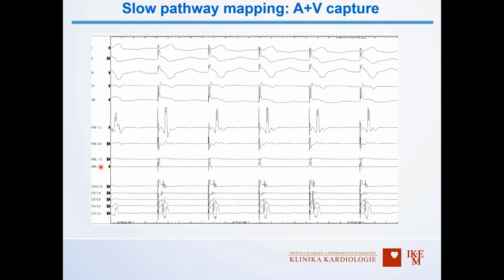A nice position of the ablation catheter at the slow pathway region close to the tricuspid annulus is associated with simultaneous capture of atria and ventricles when pacing is commenced. Capture of ventricle only or atrium only usually indicates too distal or too proximal catheter positions and is likely a less effective site for the initial burn. When this capture is consistent, it also indicates good contact and limited catheter sliding in the anteroposterior direction because of respiration.